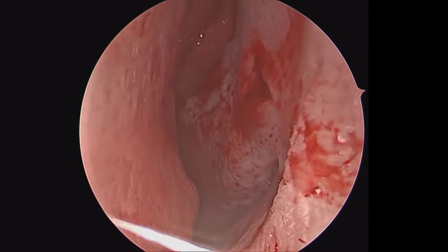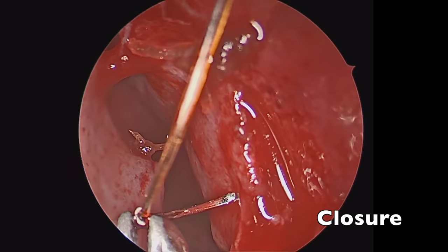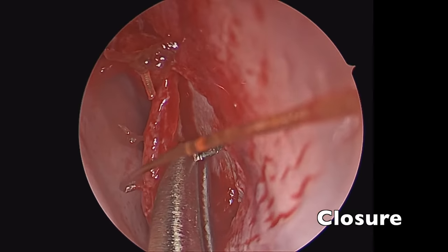We also did a submucosal resection of the inferior turbinate on the opposite side. Once we're happy with the degree of removal of the deviated cartilage and bone and have a straight septum, we can start to close our incision.